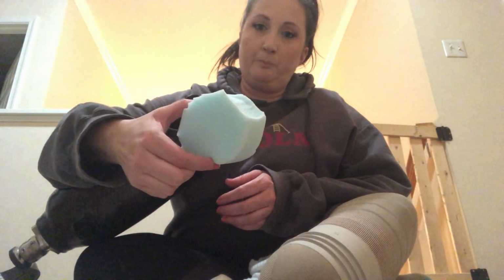I took off all of my socks, all of these socks, and I put on only my liner and my rings. And I have suction. There is no fart sound. But it hurts too bad to walk on it because I'm completely end bearing and it's not holding me up on the sides at all. So we cut a piece of foam to fit inside the bottom of my socket. But that didn't do anything. It still hurts way too bad to walk on it. So that's just to catch you up.